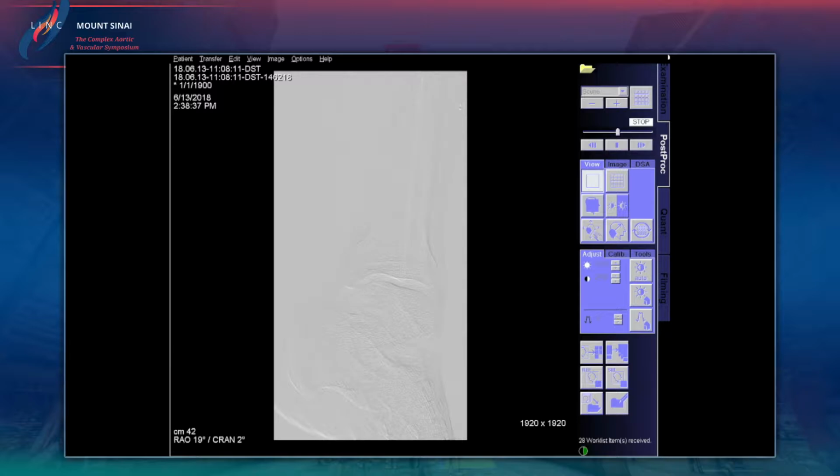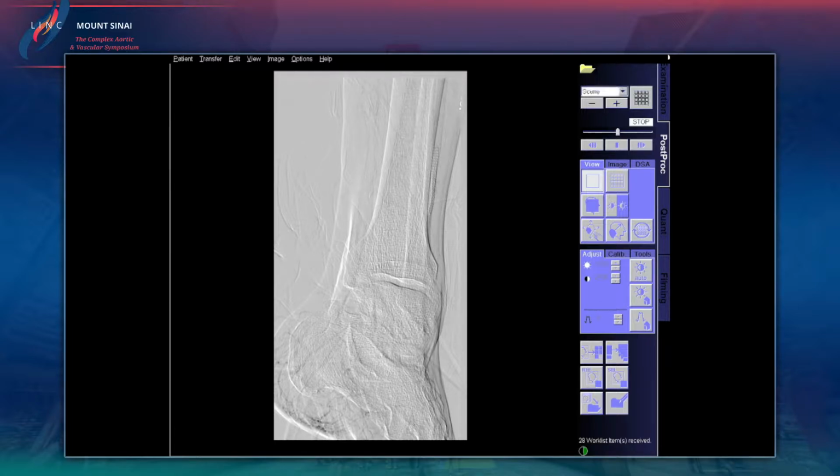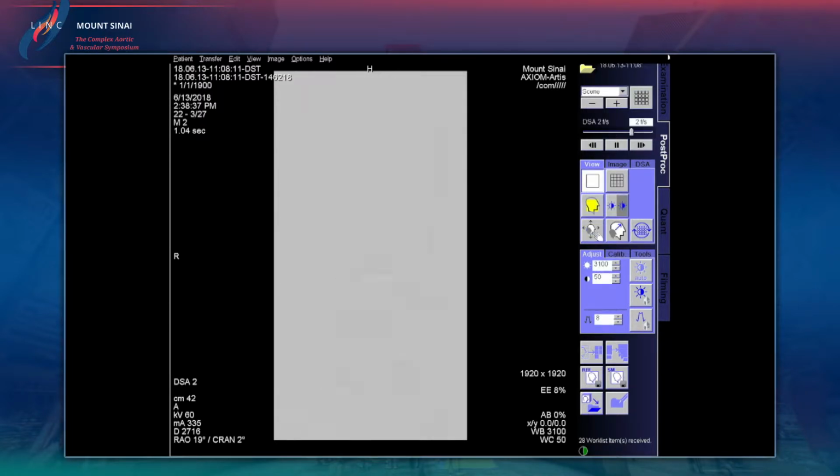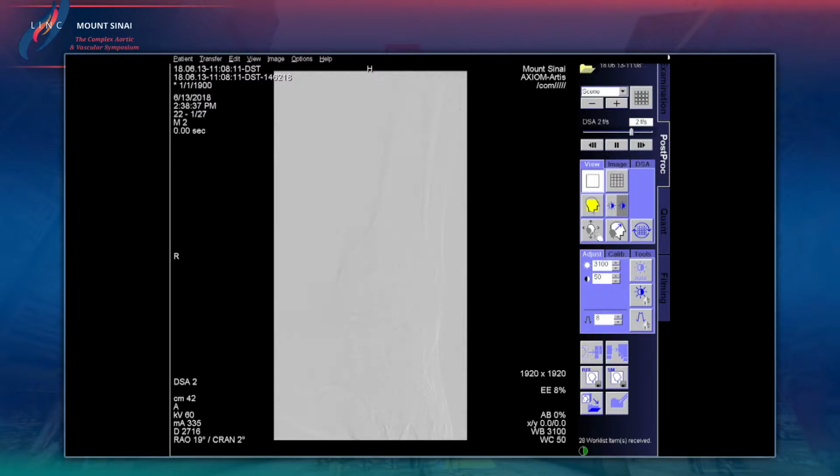And you'll see, Miguel, that the DP is quite diseased. See, the peroneal fills first. There's your AT coming in slowly. And then the posterior tibial comes in at the end, but it looks like all collateralization. And I don't know if the toe is going to get enough blood from just that anterior tibial artery, since it's also involving the plantar aspect. And angiosomally, I think you're going to need that posterior tibial. The question is, is that a true posterior tibial, or is that just a bunch of unnamed collaterals that are sort of forming that particular area?